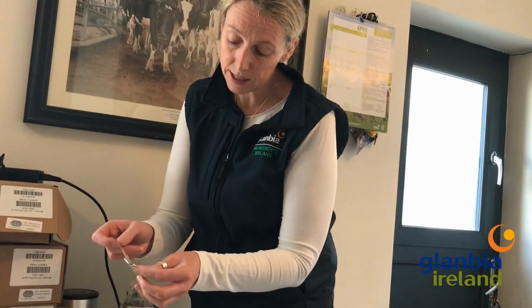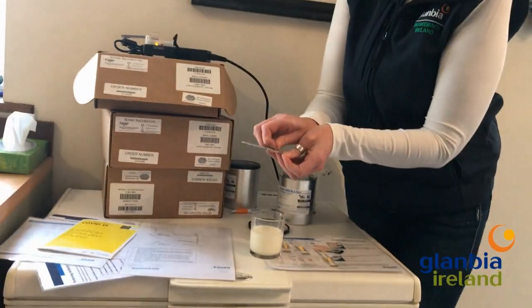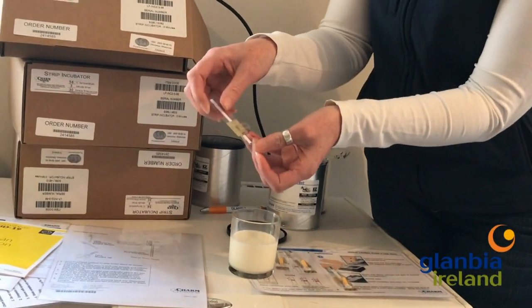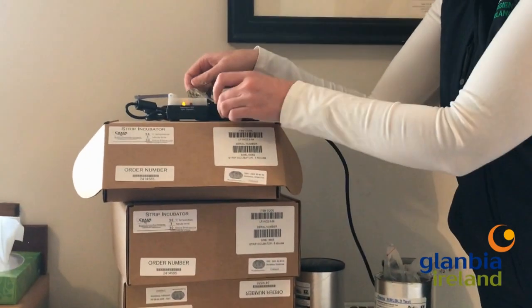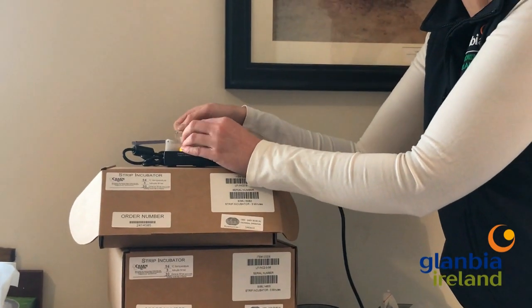Take your strip. There's a little well on it and a little tab, so you pull back the tab like that. You open it up and pop it in your incubator like that. Each incubator will test two samples at the one time.